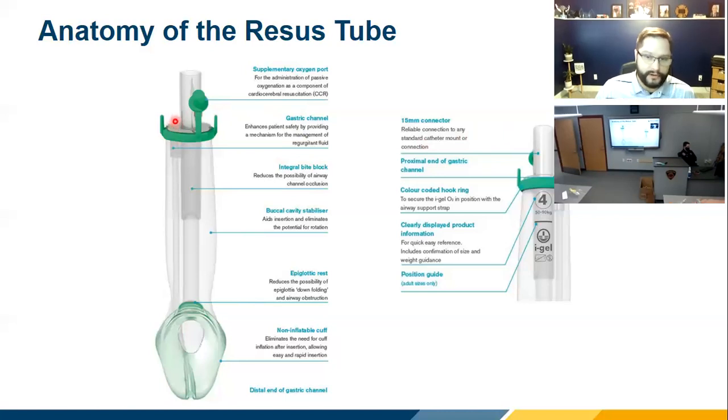Next to that is a suction port — they call it a drainage tube, but I call it a vent tube. It's really a vent: air, fluid, and things can come up, and the tube runs the full length and comes out the tip. You've been using King tubes and probably haven't had much vomit or blood come up. A week after we deployed these in a Western Wayne County department, I got a phone call asking what was wrong — because the emesis hit the ceiling of the ambulance. So it works.